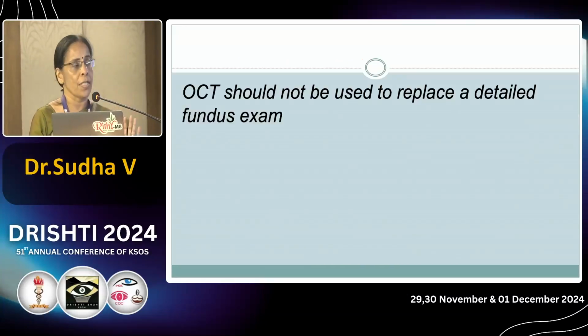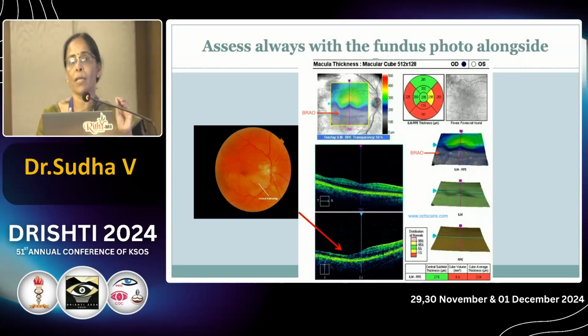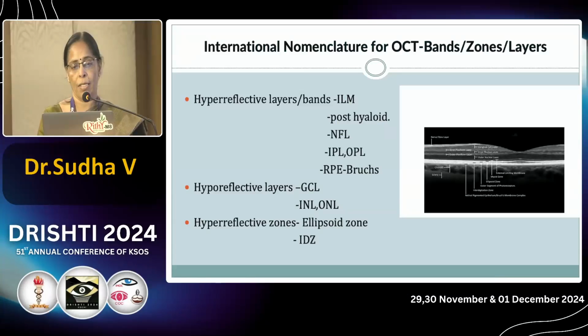So first thing first, OCT should not replace a detailed fundus examination. It is not at all a replacement. Always look at the OCT picture as well as the fundus photo to give you a hint. Some things which you should know, there is an international classification now.